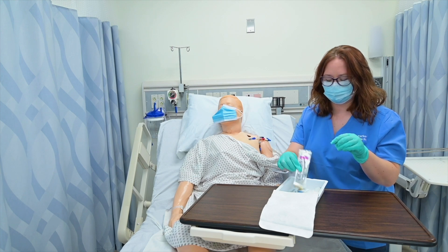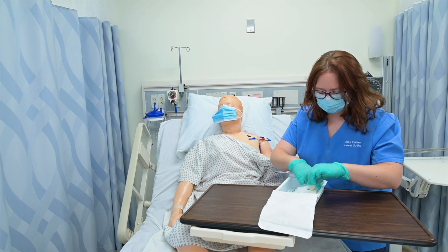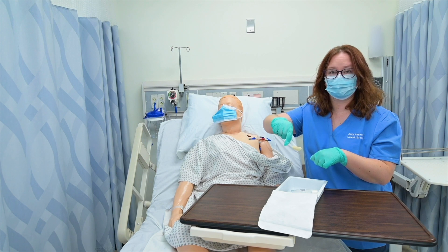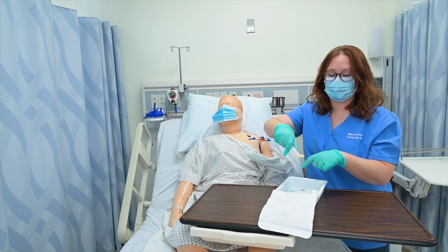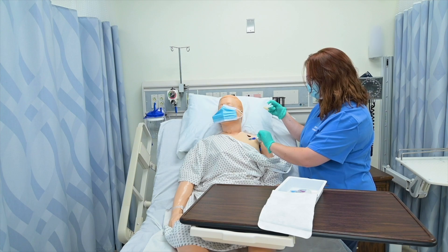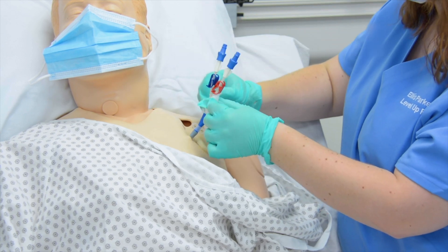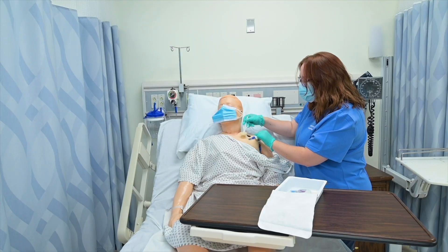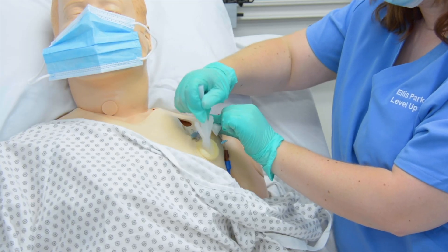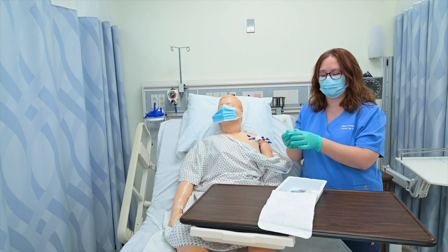In this kit, I've got things to clean the site with. I have new gauze if I need any, a chlorhexidine scrub, and an antimicrobial patch that I can put on the site itself. My first step is to hold this down and snap it, because that impregnates the scrubby piece with the chlorhexidine. I'm going to hold my tubing while I scrub my patient's site, noting that I'm pressing pretty firmly — I don't want to be gentle and tender with it, because I want to make sure I'm getting that friction in there, scrubbing all around the port itself to make sure I'm actually providing a cleaning process. I can then discard of this.